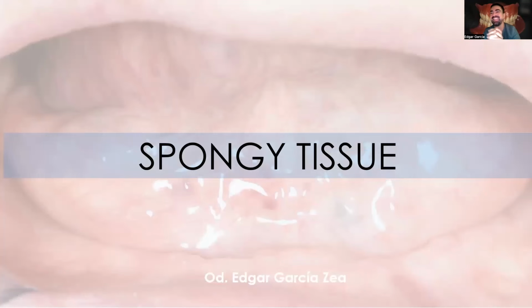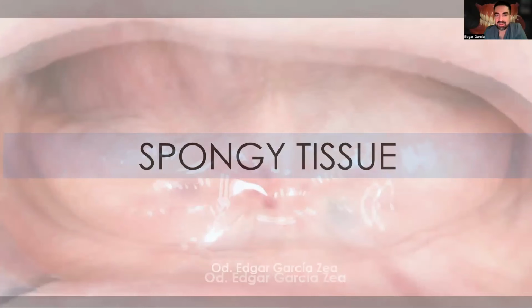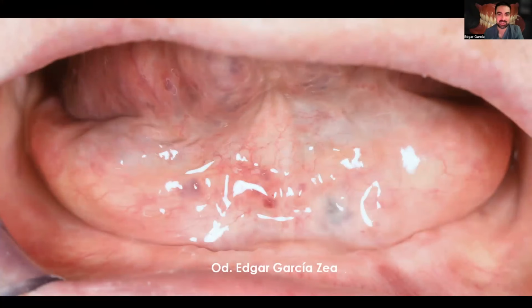First of all, it's a spongy tissue. When I was a student and I saw this kind of spongy tissue, I almost screamed because we were taught that this type of spongy tissue was going to move our denture. But nowadays, I can tell you that when we have this amount of spongy tissue, we are certainly going to have a lot of retention, because this is going to help us seal the lingual part of our denture.